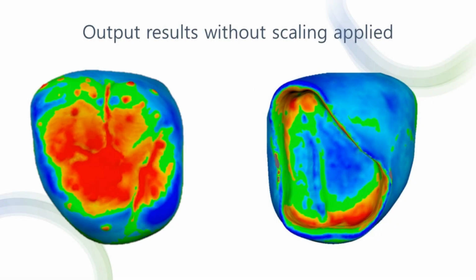This affects the precise fitting with the patient's tooth and directly impacts the comfort and functionality of the crown. On the exterior, the differences from the design are less pronounced, but discrepancies are still observed in certain areas. These can affect the crown's appearance and the patient's aesthetic satisfaction.